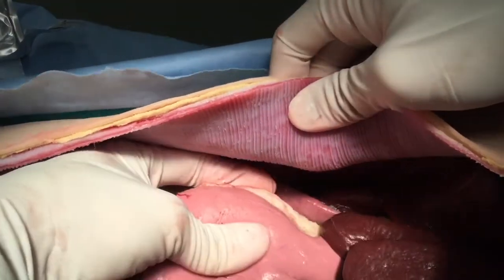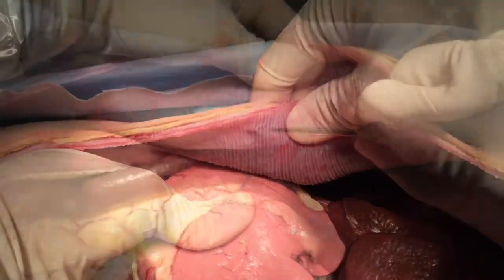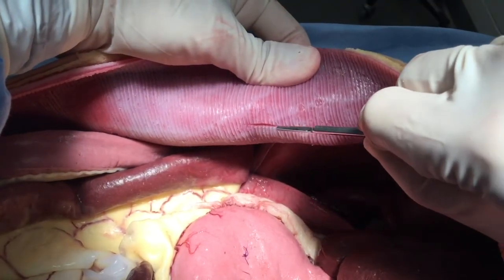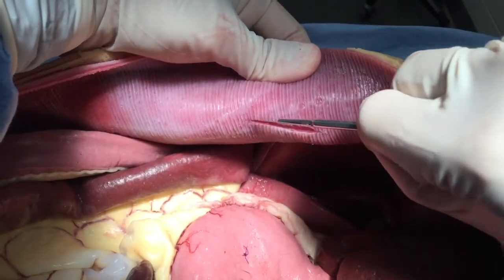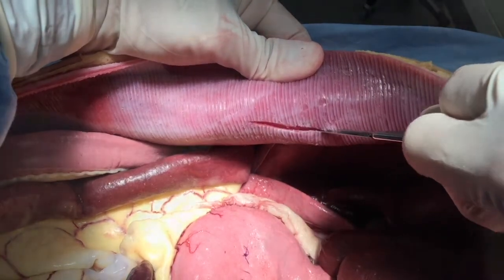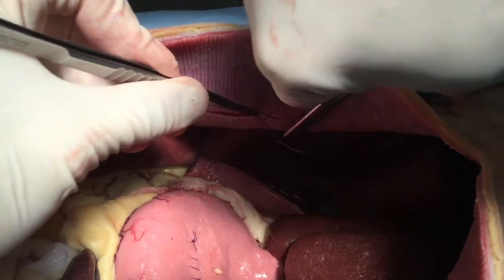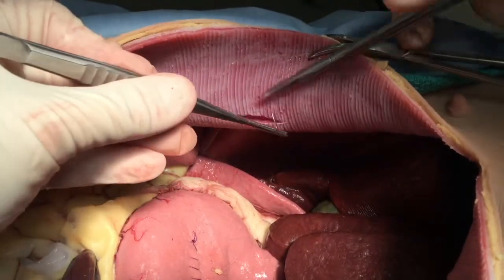The pylorus is then manipulated, mobilized, and opposed against the body wall. Once the ideal gastropexy site has been identified, a linear incision into the transversus abdominis is made. Again, this is also a partial thickness incision of the body wall itself.